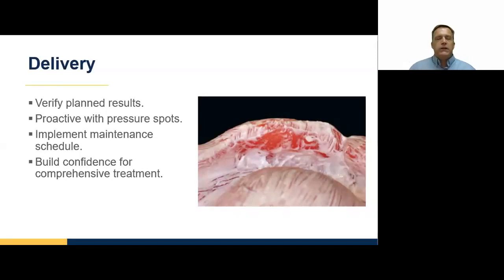Keep in mind pressure spots under the prosthetic. You'll want to check that carefully. And if you see some areas that are going to be potential sore spots, bring your patients back soon. If you get the spot when it's ulcerated, you can make adjustments, but it's so painful that a lot of times it's difficult to see if you've done enough adjustment. So kind of bringing the patient back proactively in a couple of days can be a good way to avoid things getting out of hand.